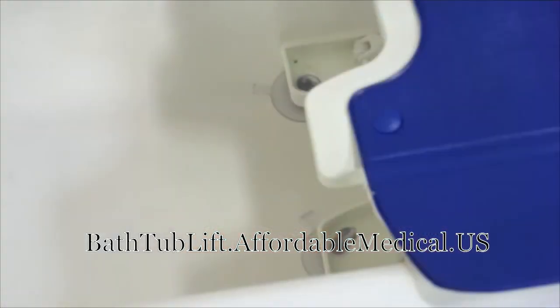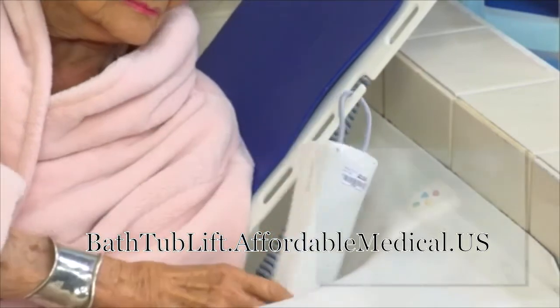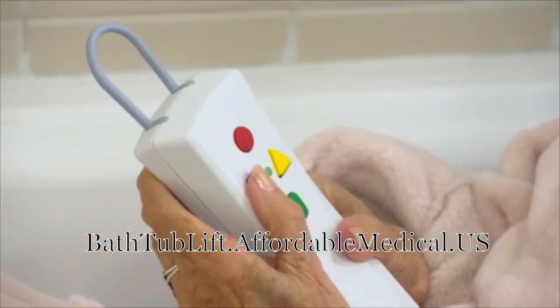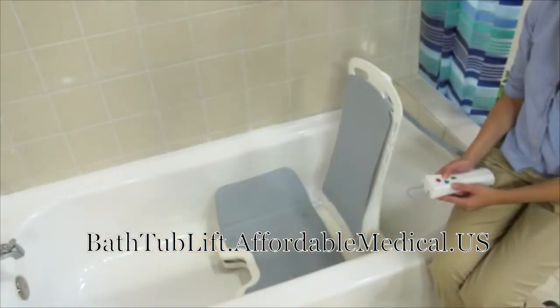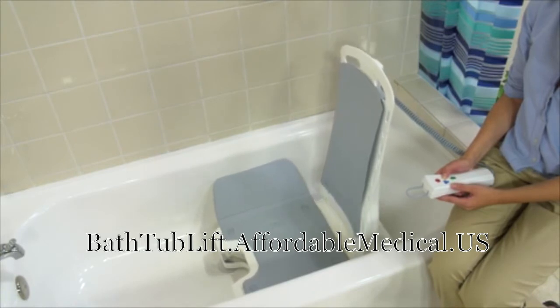Four durable suction cups stabilize and secure the bath lift. This waterproof hand remote can be hung on the hook provided on the bath lift or can float, making it convenient to access the easy-to-use color-coded control buttons while bathing.